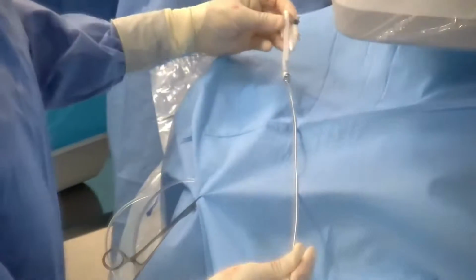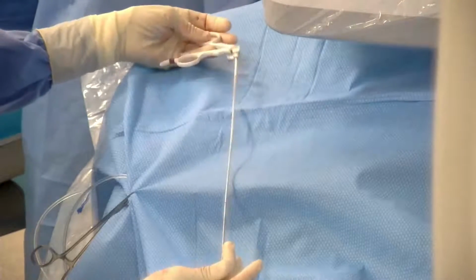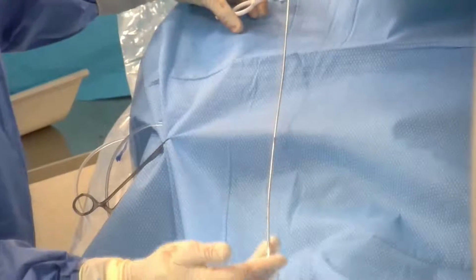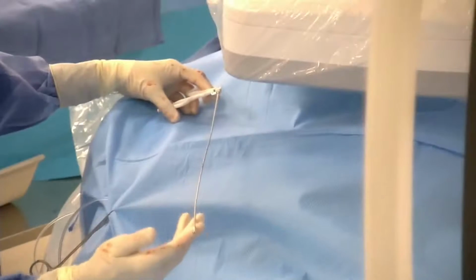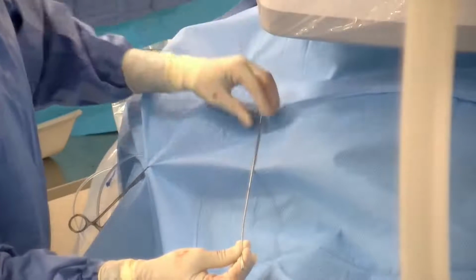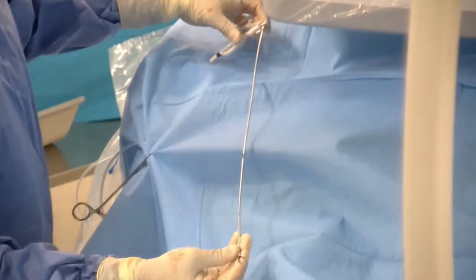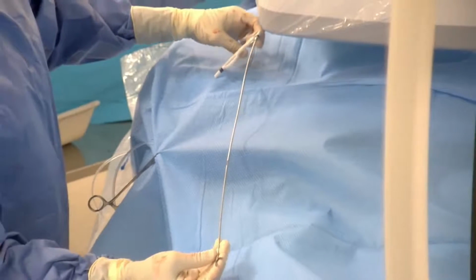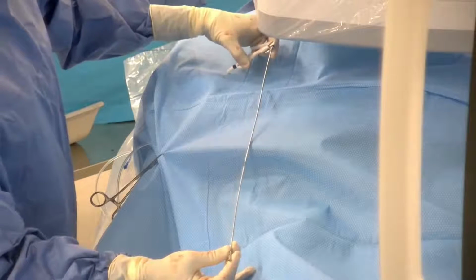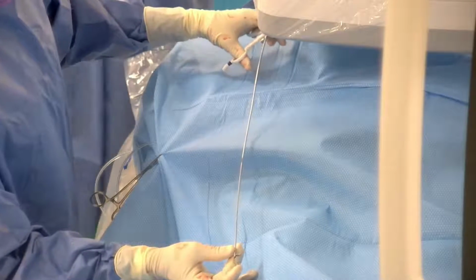So this is the Limol forceps, 4162, and it has the white handle, so this is the one that we want. It's 60 centimeters long, so you want to make sure that your sheath is 40 or 45. You don't want the sheath to be too long. It has a 3mm shaft, and the jaws themselves are between 4 and 5 millimeters, with alligator teeth and an articulating arm, which you can control with the handle here, and then a more straight arm.